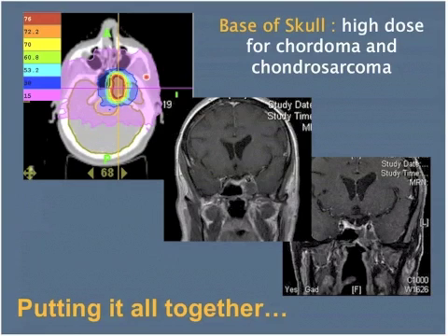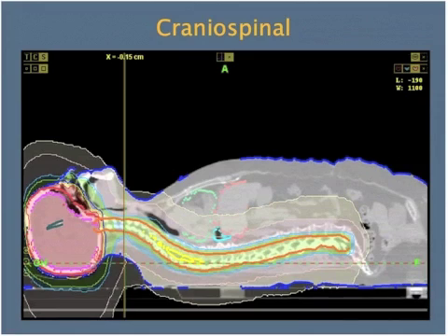So we used a daily image-guided IMRT to deliver a dose of 76 gray to this lesion, which is proton-level doses, but we were able to accomplish this with our photon machine, and we can see the before and the after, showing an early response of this tumor, and this patient has had durable control, and we were able to establish a very sharp dose gradient with an adjacent organ at risk, the brainstem, and this patient has had no adverse consequences from his treatment.